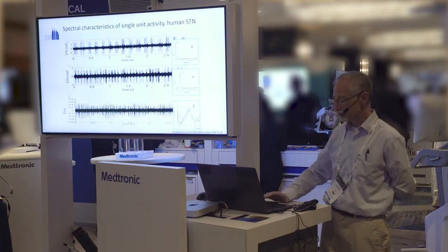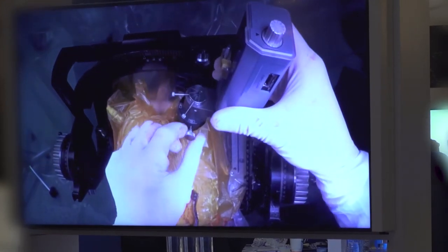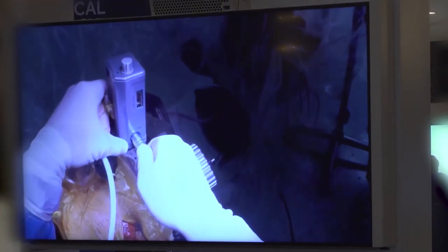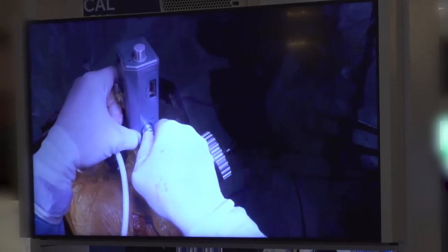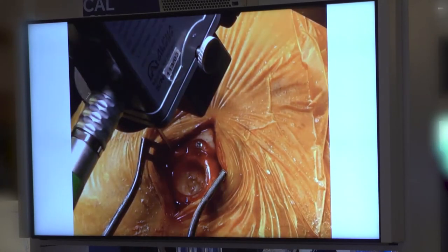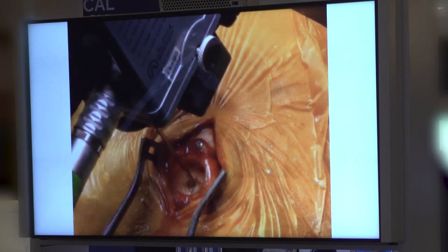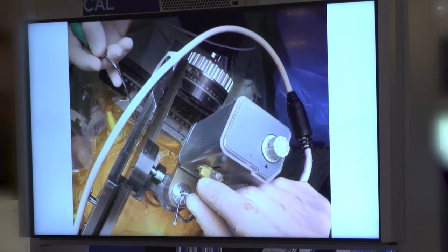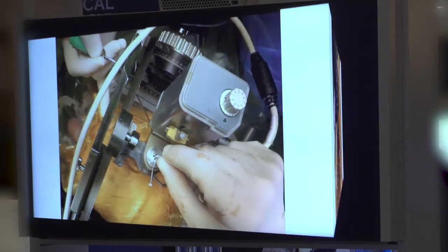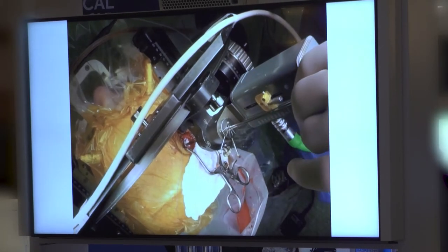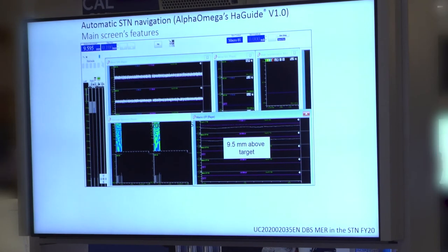To show how we tackled the issue of finding where spatially to put these electrodes: this is the Alpha Omega microdrive — one of their models — going into place. It's a single cable attachment to the computer that stands at the side. I personally will use dual cannulas most of the time, because we record through two microelectrodes. Here you can see it going through the burr hole, the second electrode going in, connecting up, and passing two microelectrodes down. This is what the graphic interface looks like when we record.